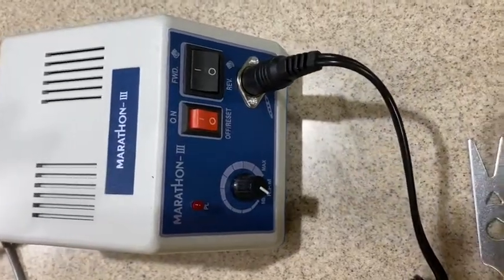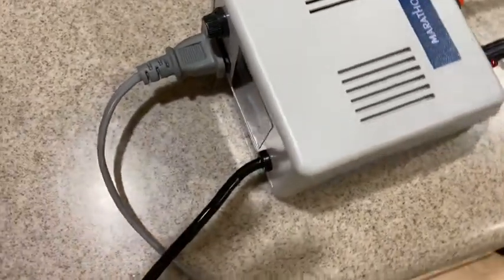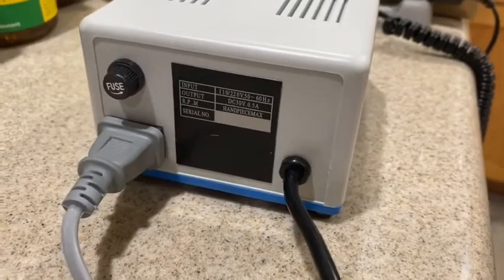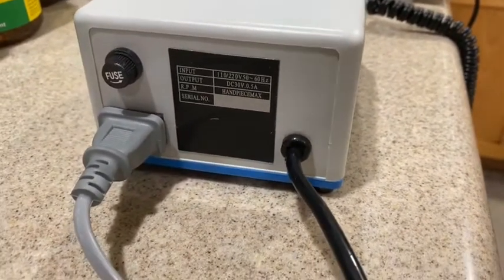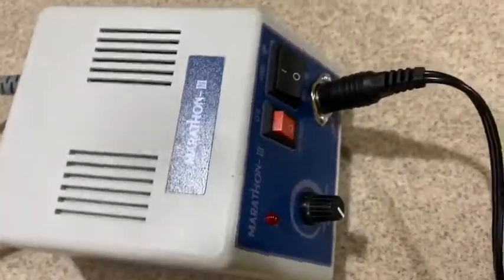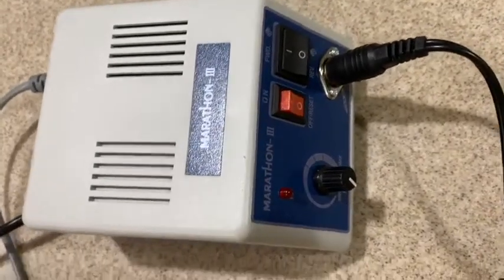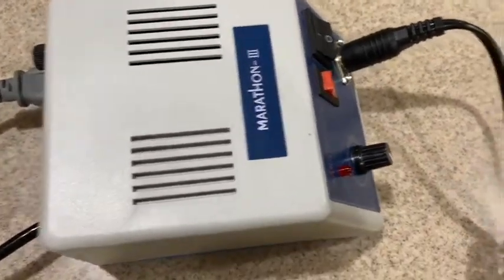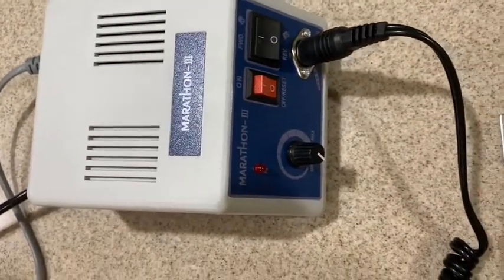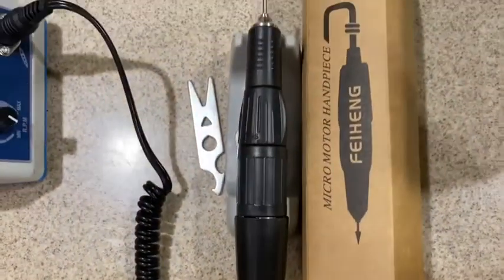Hey, hello everyone, welcome back to my YouTube channel. My name is Dr. Wynn. Look what I just got from Amazon — this is a device for adjusting dental stuff such as orthodontic retainers, denture adjustments, night guards, and things like that.